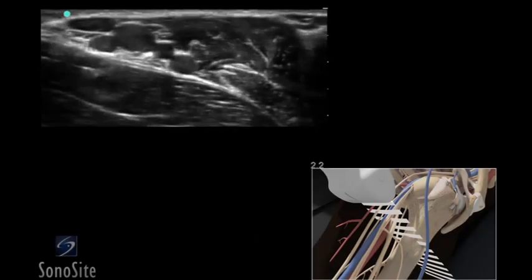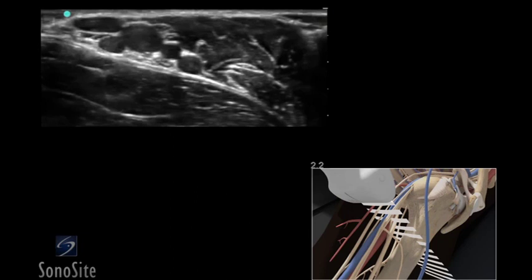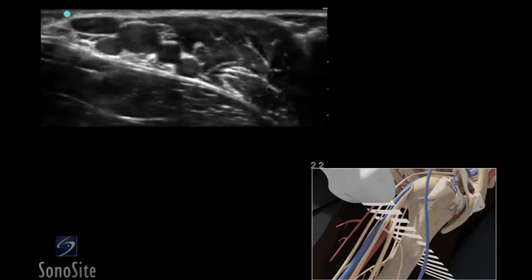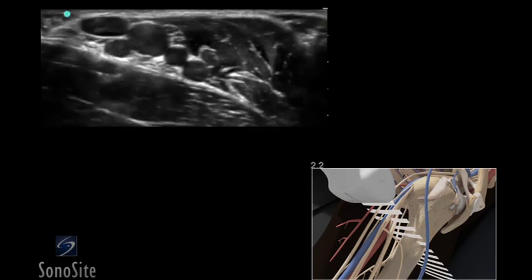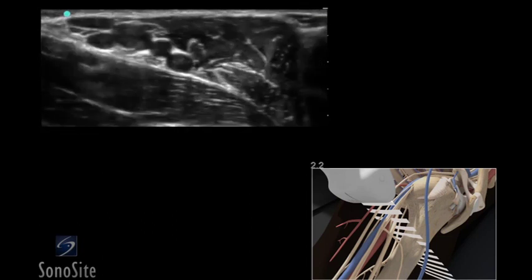A linear array transducer with a nerve exam type is used to perform an ultrasound-guided axillary regional nerve block. The target depth is approximately 1 to 2 centimeters in an 80 kilogram adult.